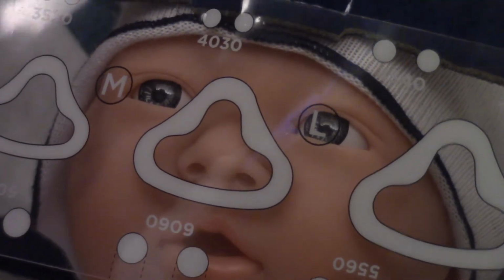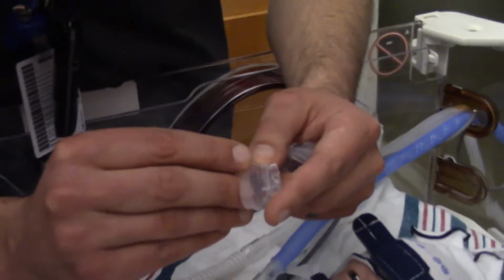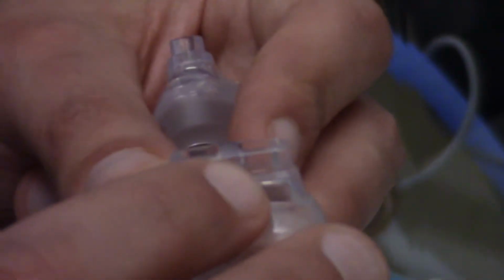We have plenty of room on each side of the nare, and the top of the mask is sitting perfectly on the bridge of the nose. So then, come over here. It's really hard to see, but you'll be able to see they're right here. There's a large and an extra large. It's got a little XL right there, and the large would be right there. It's going to be really hard to see in the camera, but on the right side of the mask you will be able to see it.